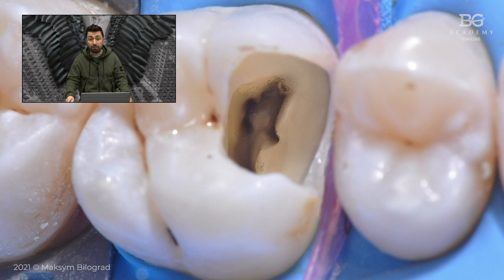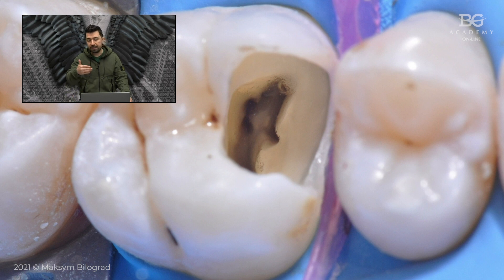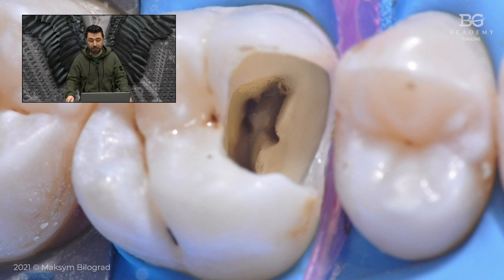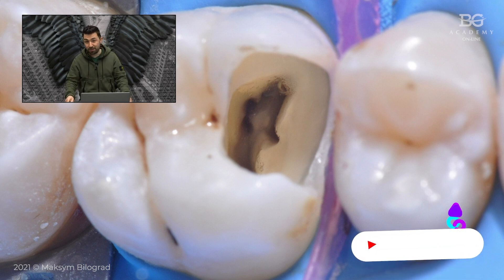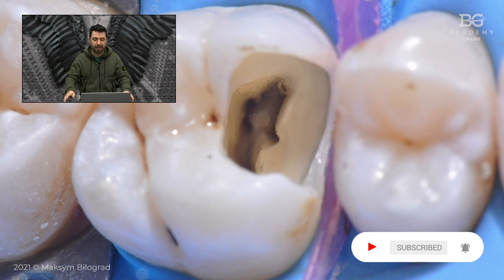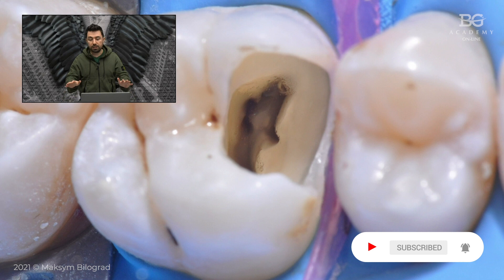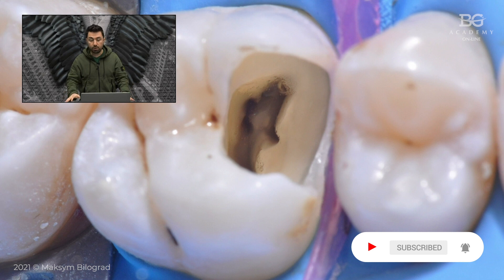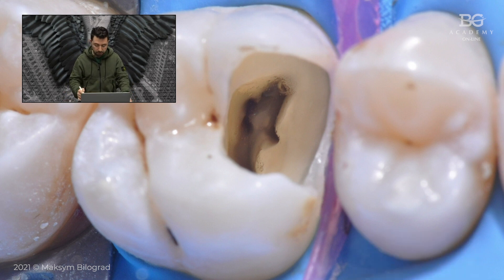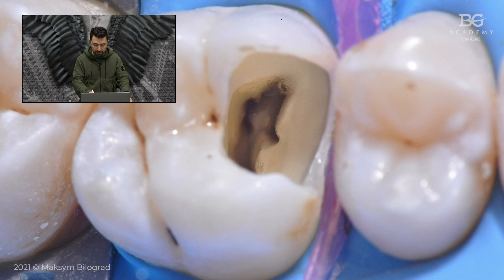When you have deep proximal defects, this wedge may protect the rubber dam and you will not tear it during the preparation process. So, we opened the chamber, we removed the caries, and the wall here became very thin.